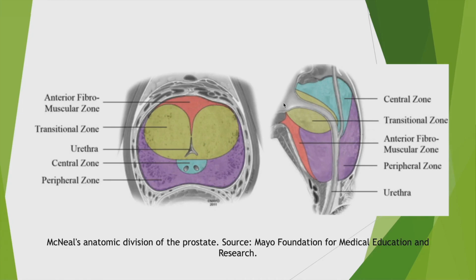The bladder is shown here in the sagittal section. So our patient has a full bladder. He's peeing like this, so it's going down the urethra. Well, here we are finally in the anterior zone. The peripheral zone will ultimately be the most inferior part. We'll come back to the comparison between these diagrams and sections in a moment.